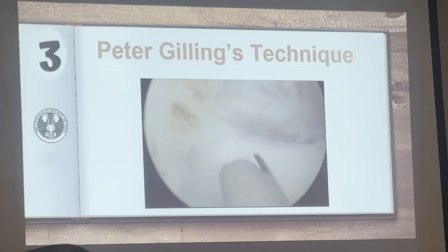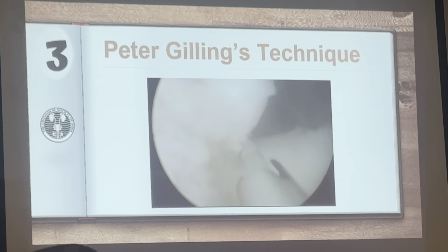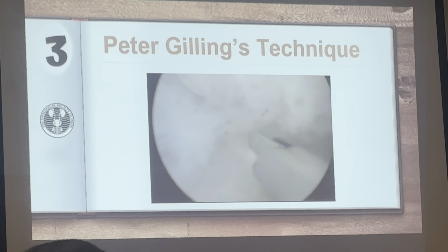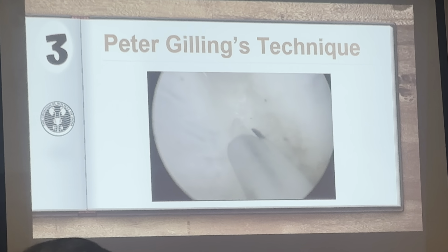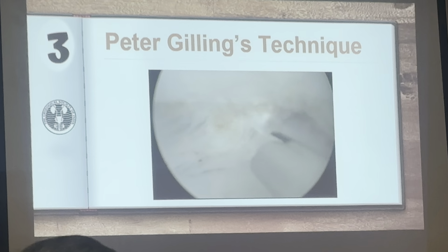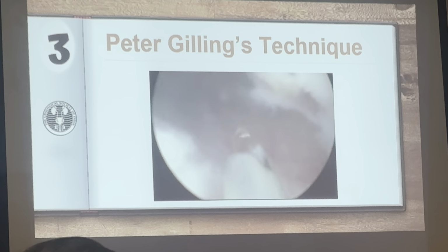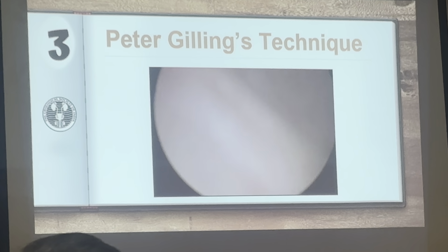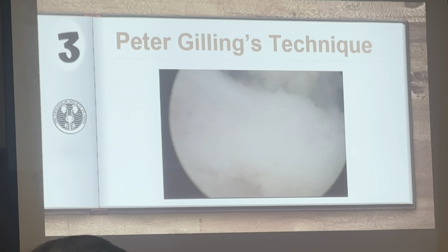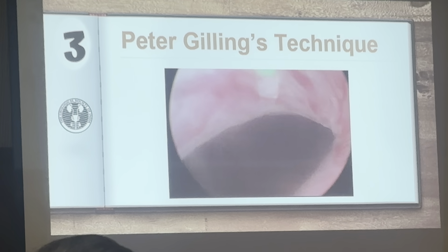So now you can see there are hardly a few fibers attached at the bladder neck. And once we do that, the median lobe gets enucleated. After taking down those final fiber attachments, the median lobe goes into the bladder. The moment the median lobe is enucleated, it helps us in two ways. Number one, if you're doing your first few cases, it will do a huge good to your confidence that you have done something creditable. Secondly, there will be a lot of improvement in the fluid dynamics. So once we take out this median lobe, your fluid dynamics will increase.